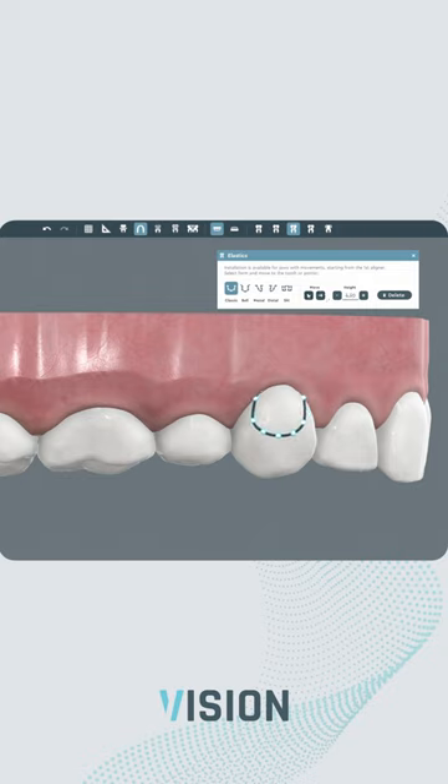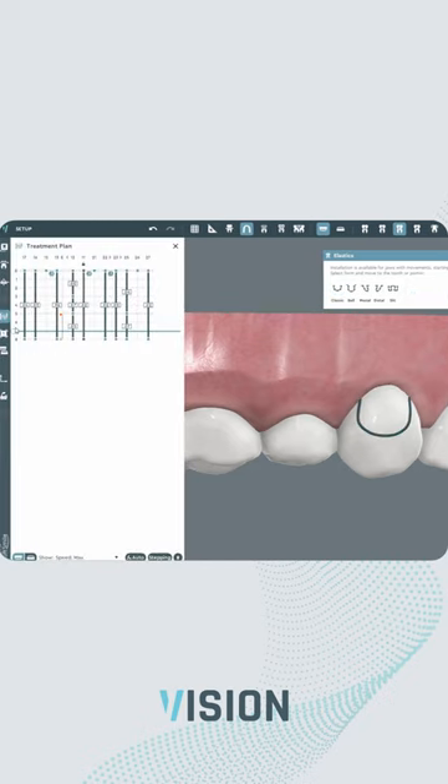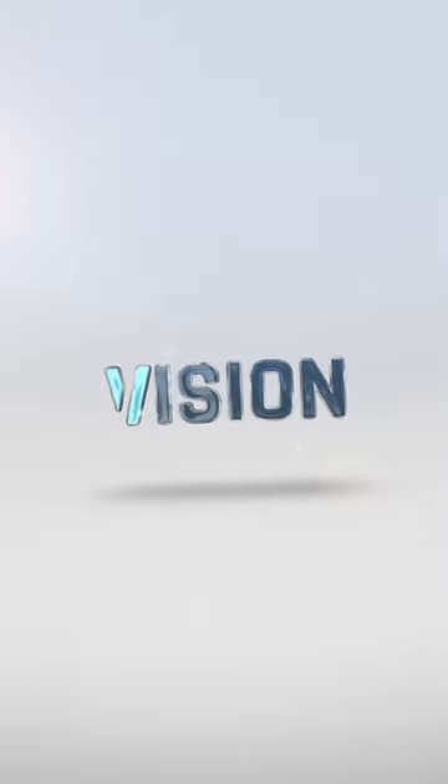For the button cutout, experience the ease of modifying its position and height. Additionally, the cutout's lifetime can easily be managed in the treatment plan. Where innovation meets customization.